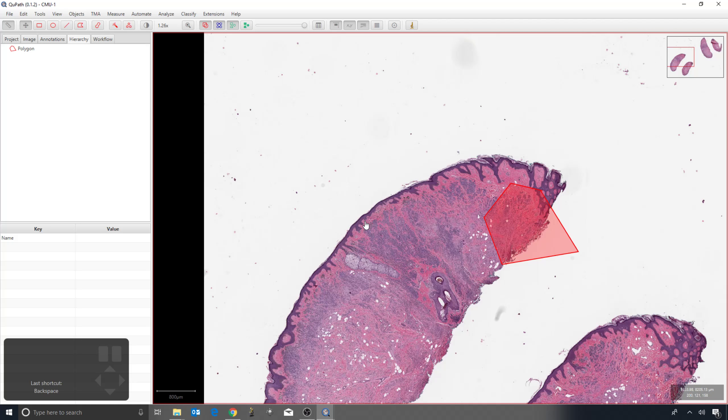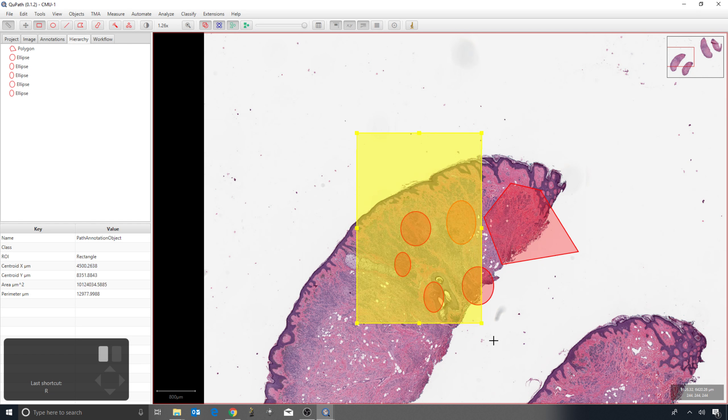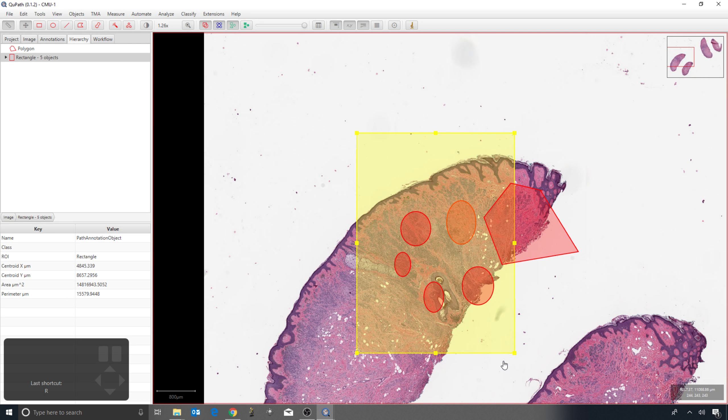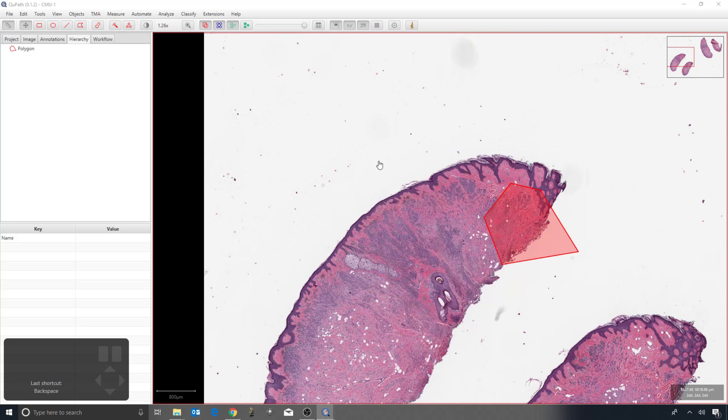It's something to be aware of and you can use to your advantage. If you have multiple annotations you want to get rid of, you can draw one larger annotation around them, press backspace, don't keep the descendant objects, and that will help to remove them.